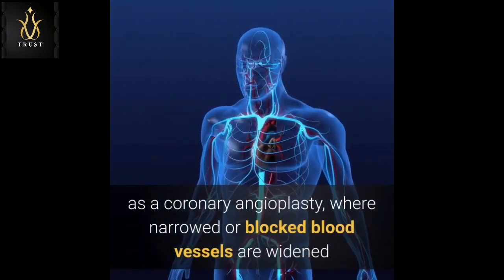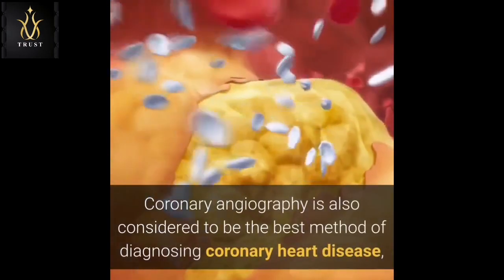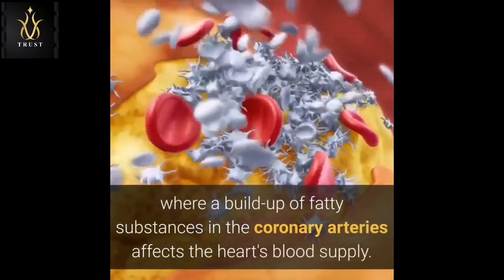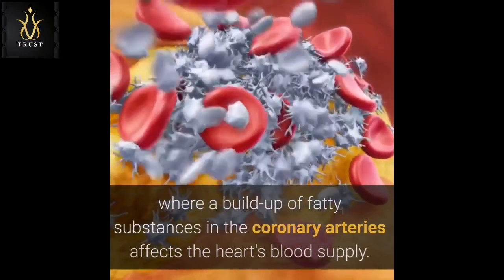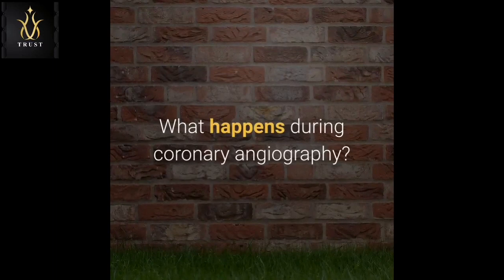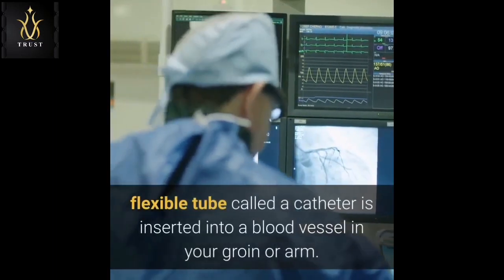Coronary angioplasty is where narrowed or blocked blood vessels are widened. Coronary angiography is also considered to be the best method of diagnosing coronary heart disease, where a buildup of fatty substances in the coronary arteries affects the heart's blood supply. What happens during coronary angiography?